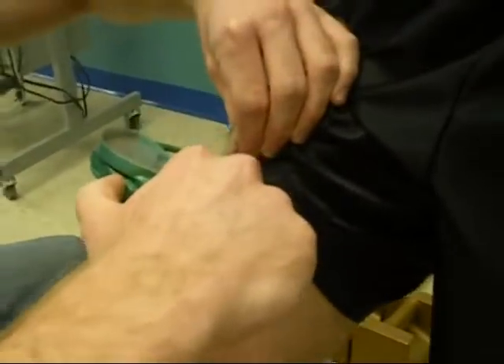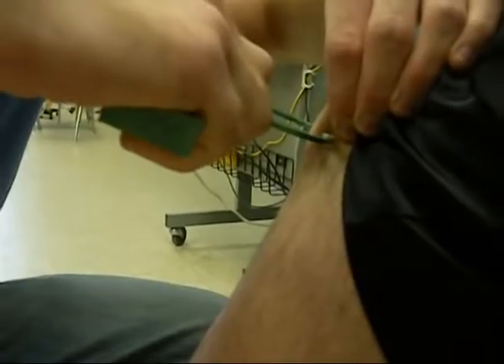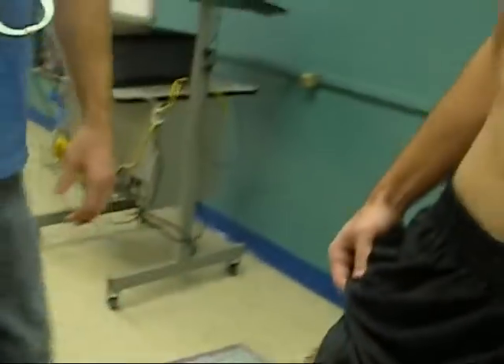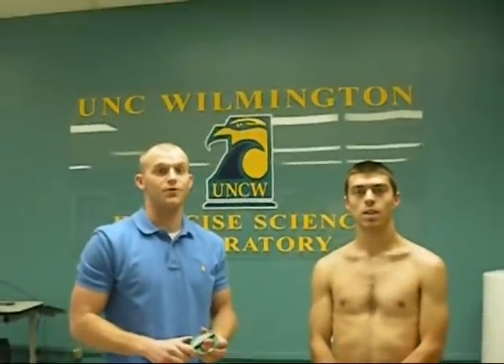Separate the fat from the muscle, clamp down, take your reading, and release. And that is the three-site skinfold for males.